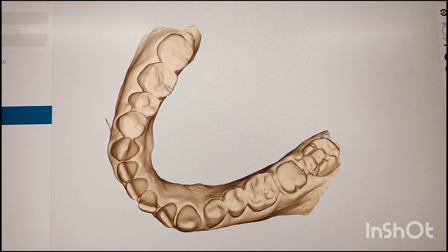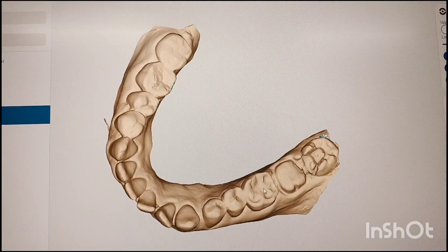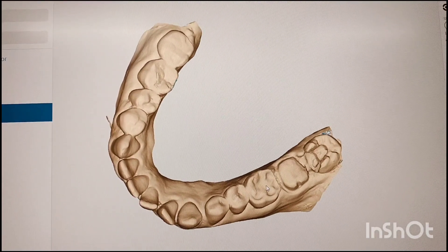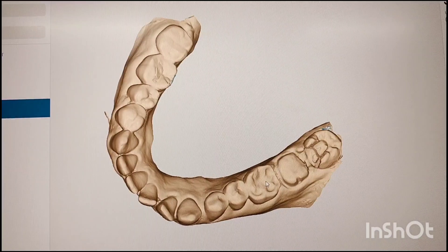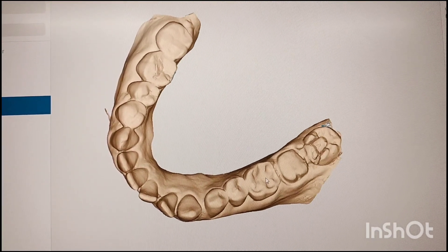What is an inlay? Inlay is basically an indirect restoration, an intracoronal restoration which is luted onto the prepared cavity. We are going to bond it with the help of resin cement.